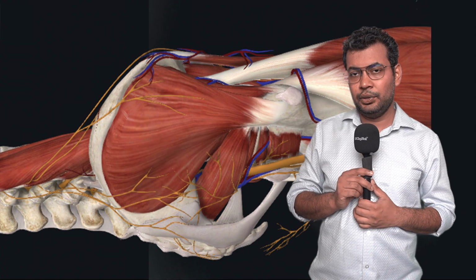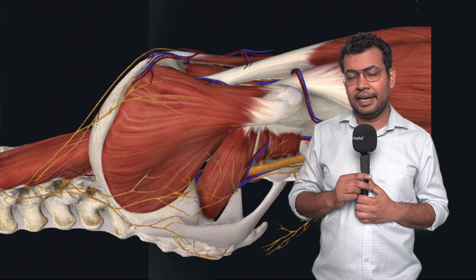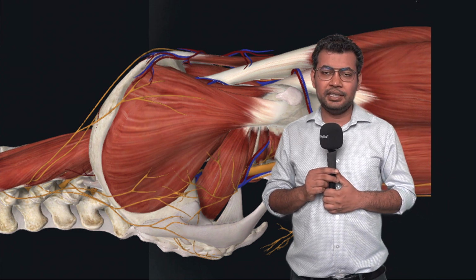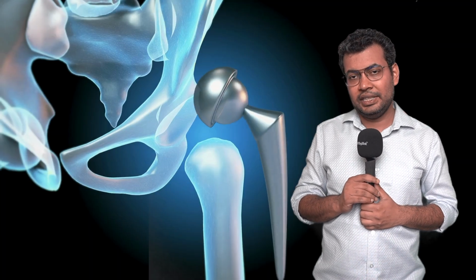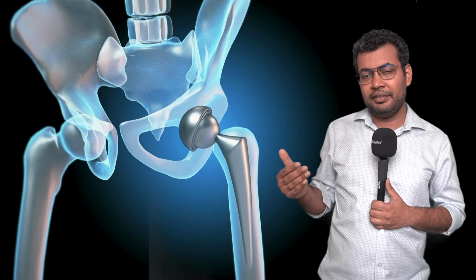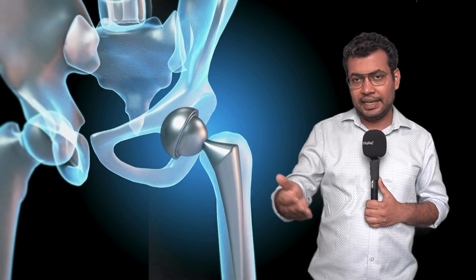As soon as we cut the gluteus maximus sleeve, we retract the gluteus maximus muscle on the posterior and lateral aspect. We will then have the exposure of the sciatic nerve. Here we will have to protect and separate the sciatic nerve. After the protection of the sciatic nerve, we cut all the external rotators 1 centimeter away from the femur. So now we have done the resection on the posterior aspect, where we have cut the gluteus minimus, medius, maximus, and the external rotators. Now we go on to the medial side.